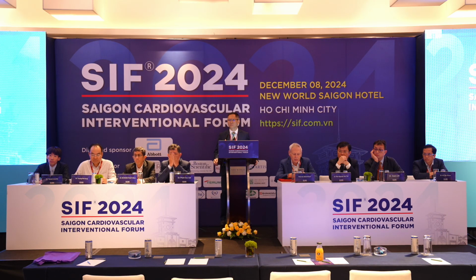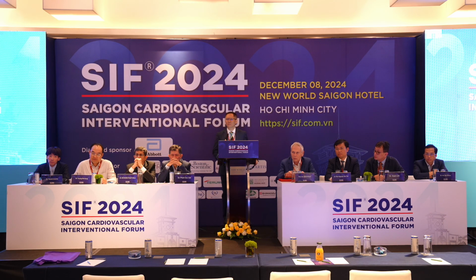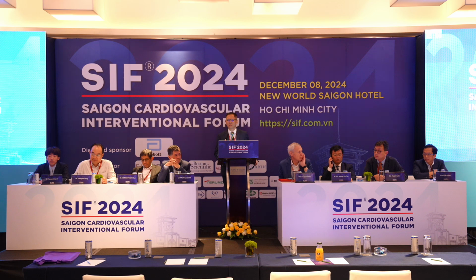And like in your lecture, when you see the distal flow, you try to put in a stent, but in our experience, sometimes the large thrombus burden moves to another place. So sometimes when you aspirate everything, the coronary artery may be very normal. So I think that instead of trying to put in a stent, it's better to aspirate everything before you decide to put in a stent. Here I would like to ask about the experience of using a small dose of fibrinolytic to inject to make it easier to aspirate.